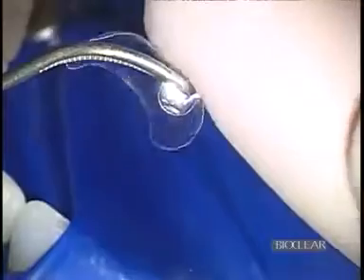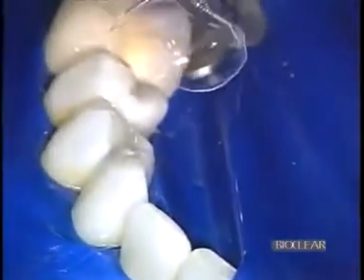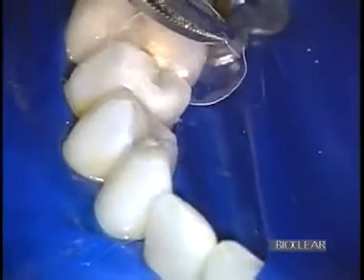For posterior teeth, such as this bicuspid, it is helpful to bend a contra angle on the tab, and then place the matrix on the tooth. Later on, you can bend the tab straight, or even backwards, to get it out of the way for composite placement.